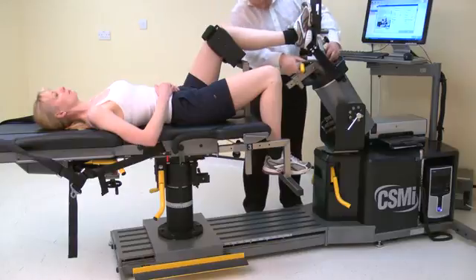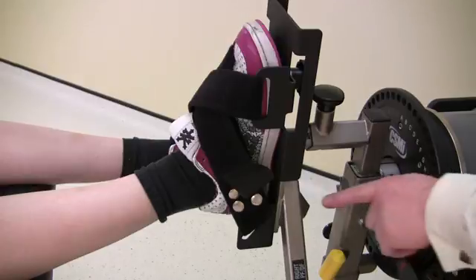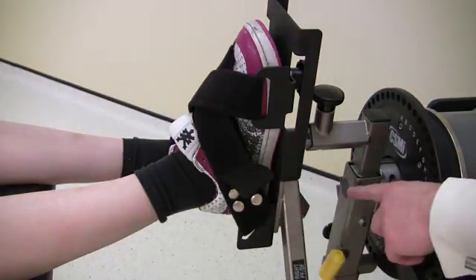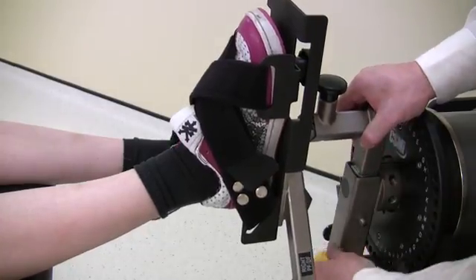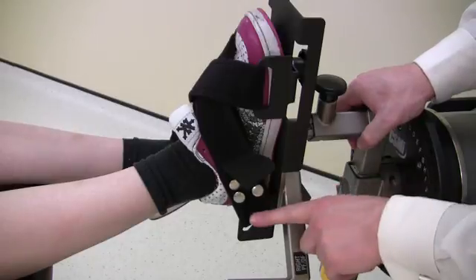Before fully securing the foot to the footplate, adjust the axis of rotation. The axis of rotation for inversion and eversion is set once the heel of the foot is opposite the black dot on the dynamometer input arm. Adjust by loosening the ankle adapter and extending or shortening the tube.